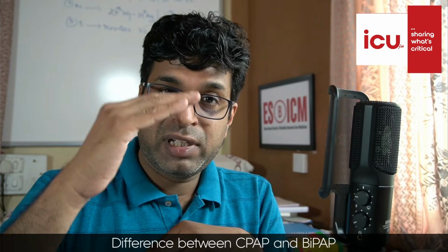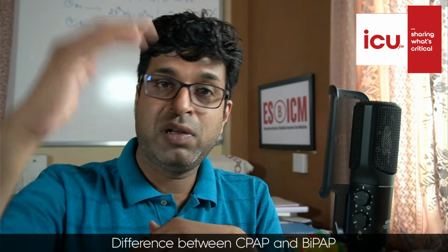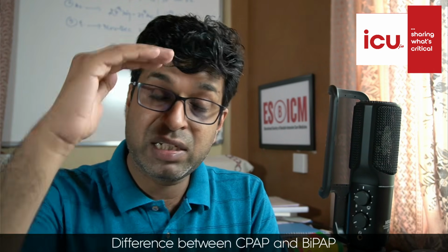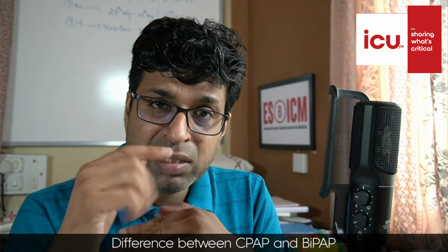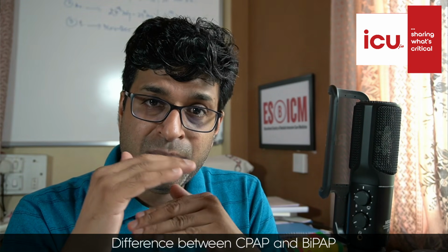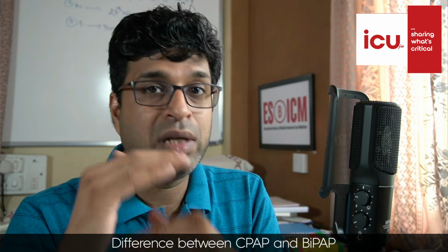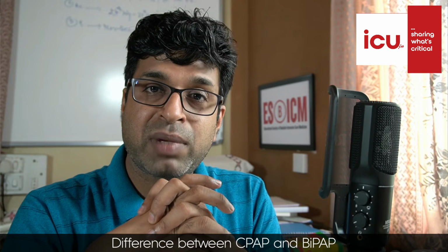The greater the difference between IPAP and EPAP, the more your PCO2 levels will fall. So if you need to adjust the PCO2, increase the IPAP and increase the difference between EPAP and IPAP. It is the difference between IPAP and EPAP which actually makes a difference in the PCO2, not the absolute values. So this was in a nutshell about the difference between CPAP and BiPAP.